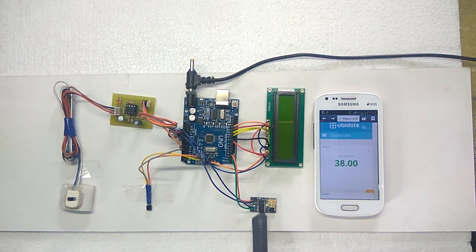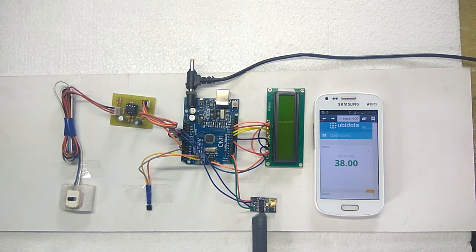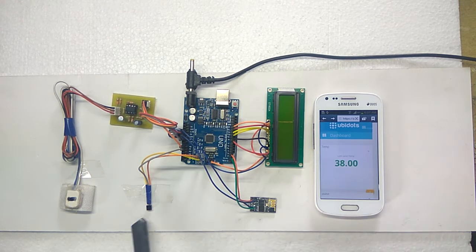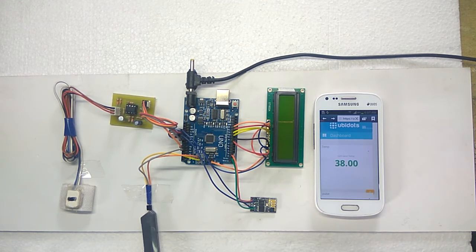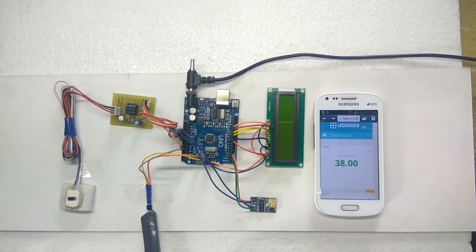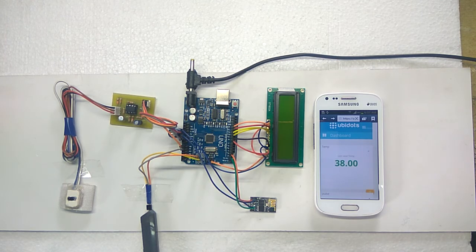WiFi module ESP8266. It is used to communicate Arduino to the internet. Temperature sensor LM35. It is used to measure body temperature.